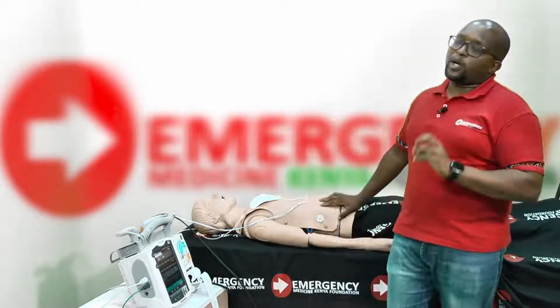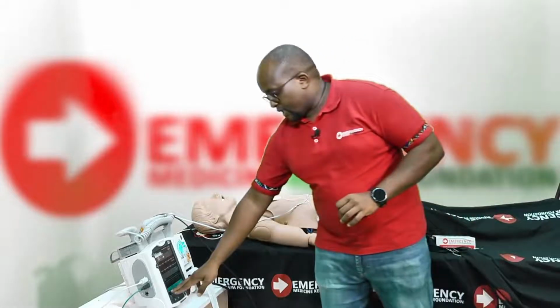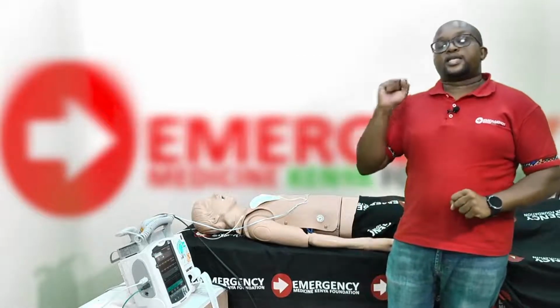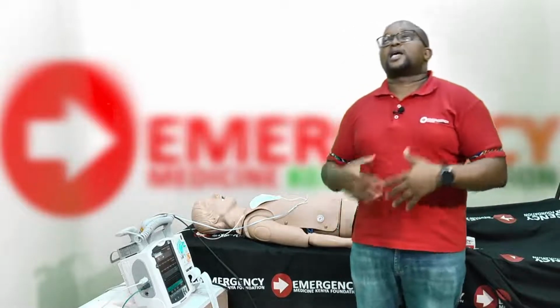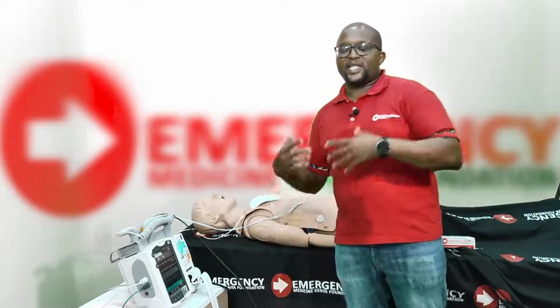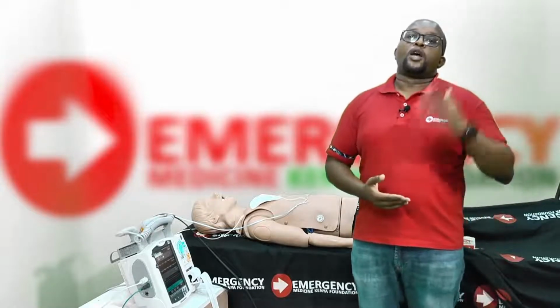Now, there's only one more thing that I want us to discuss. On the screen you can see it says demand mode. There are two forms of pacing modes: demand mode and fixed mode. As the word suggests, demand mode means the machine will pace on demand, when the patient needs it. On fixed mode, the machine will pace continuously.